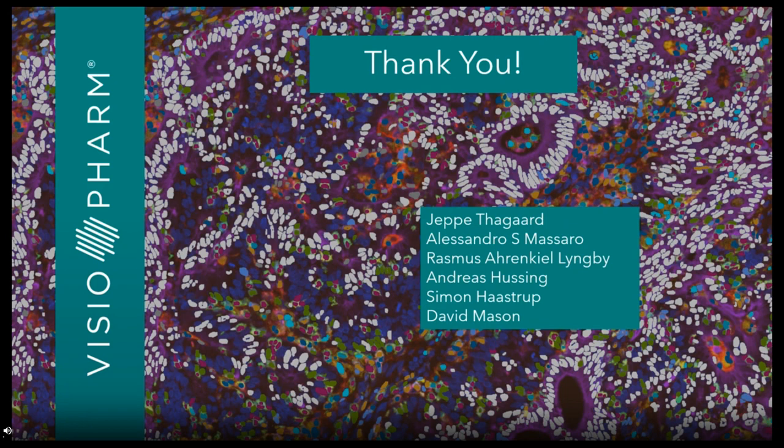It really depends a little bit also on the customer request. So in-house, I think usually we use 4 micron slide thickness, but there are some customers that also request 3 and some others that request 5. I don't think it changes a lot in terms of the cell detection because you are still below the size of the cell. So if you look at serial sections, if you have 4 or 5 microns, you are not looking at the exact same cells. So maybe Fabian, if you want to comment further on the thickness and how this would impact the analysis.